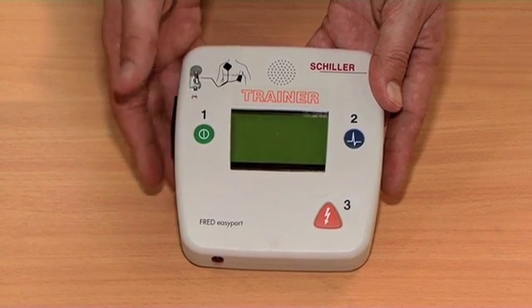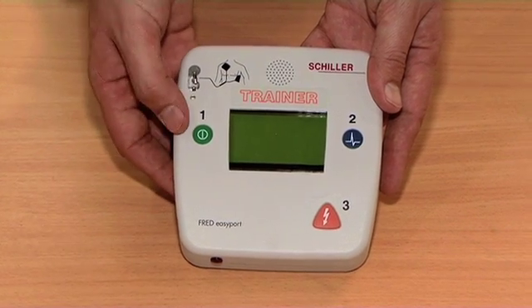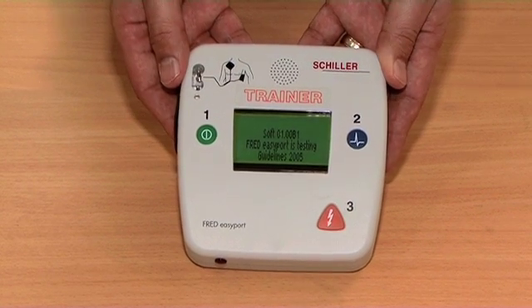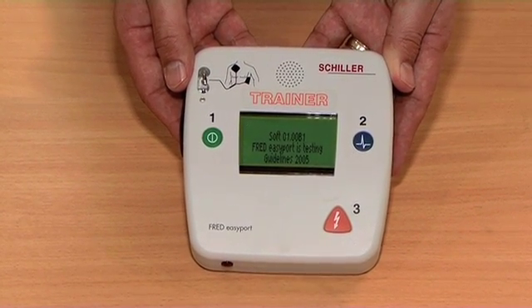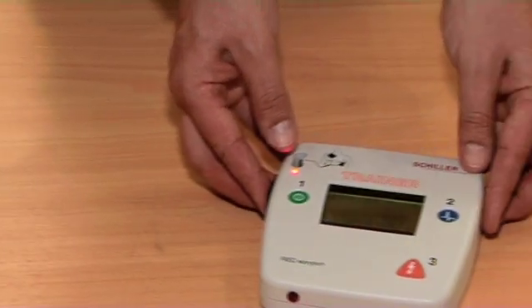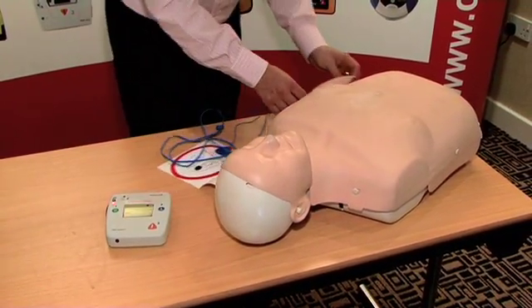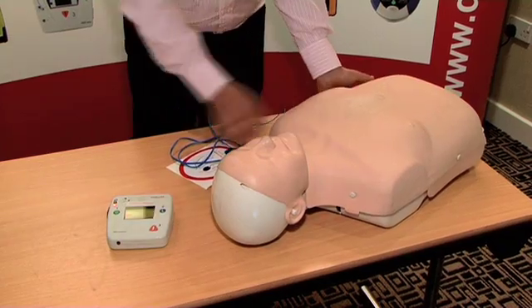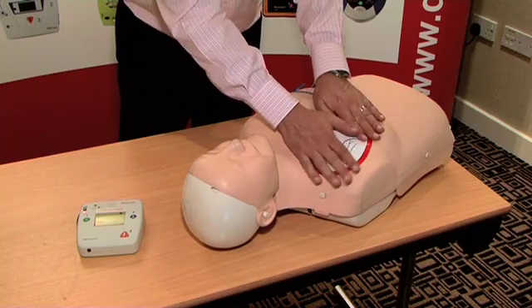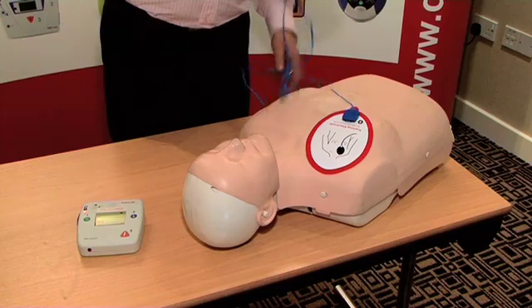So let's switch the machine on. This is a training unit and will allow us to run through the entire scenario. Use the green button to switch it on. There's a quick self check. Place electrodes on chest and plug into machine. The device is asking to place the electrodes on the adult's chest.